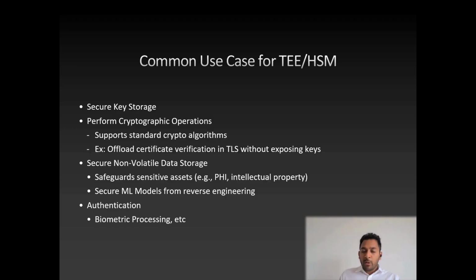You can also use this as a general purpose storage medium where you can store PHI or any other sensitive data. You can also secure your AI/ML models that are used to predict some kind of output, like cancer or any operations. So you can secure those models from being reverse engineered. You can save those models and securely run them in the TEE, but you also need to make sure it has enough memory so the performance doesn't take a hit. It can also provide secure biometric processing if your device has one.